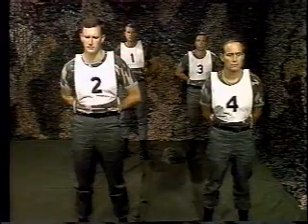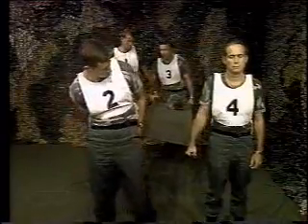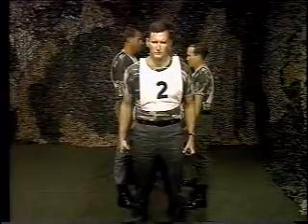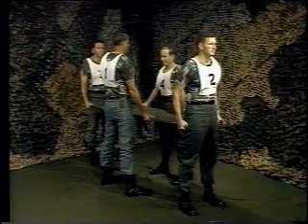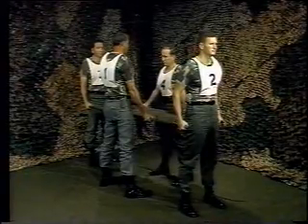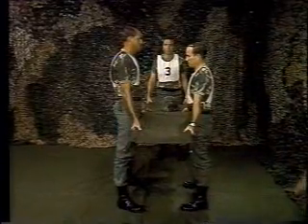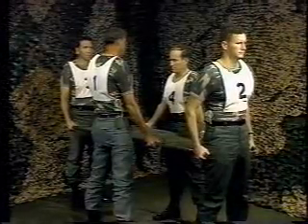Demonstration team. Prepare to lift. Lift. Litter post carry. Move. Got it. Got it. You've noticed that as these teams have been transferring the weight of the litter, they have been talking to each other, ensuring that they don't drop the patient. In this carry, if one of our team members, such as the number 2 man, were to trip and fall, the team still has adequate support. Once he recovers himself, he can move right back in to help the team.